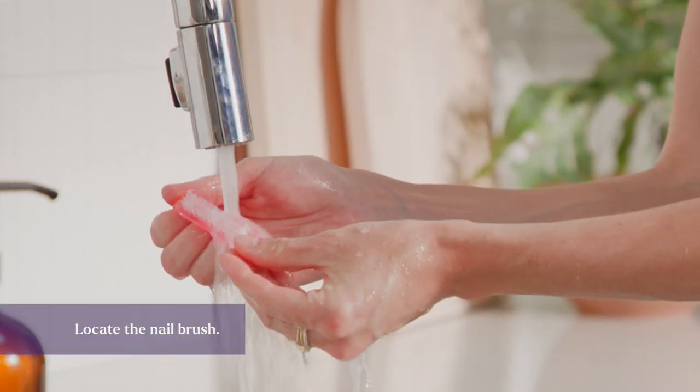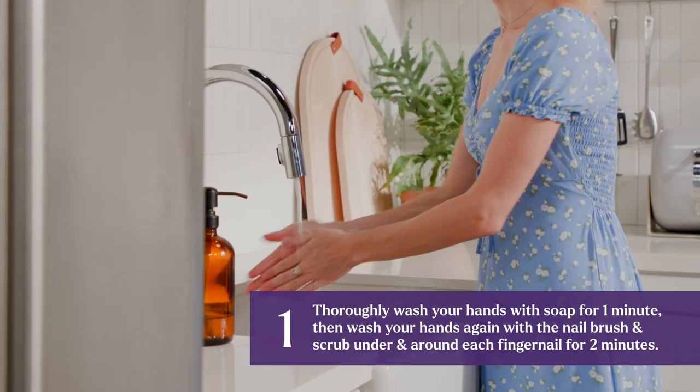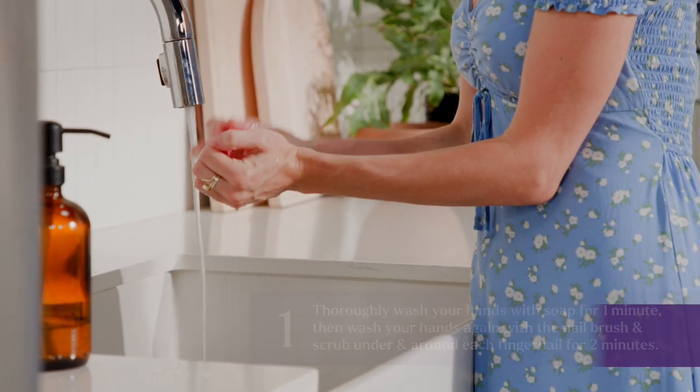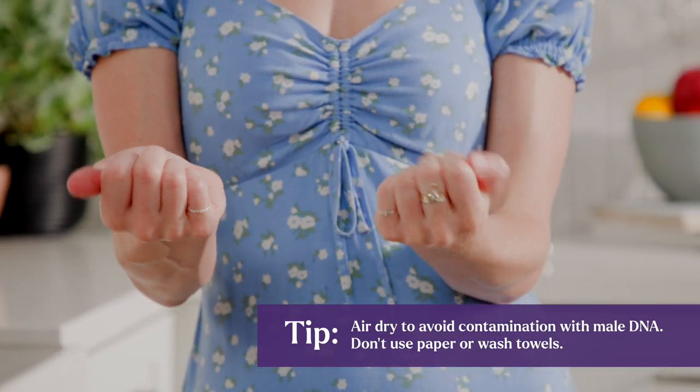Locate the nail brush in your test kit. Thoroughly wash your hands with soap for one minute, then wash your hands again with the nail brush and scrub under and around each fingernail for two minutes. Let your hands air dry to avoid contamination with male DNA.